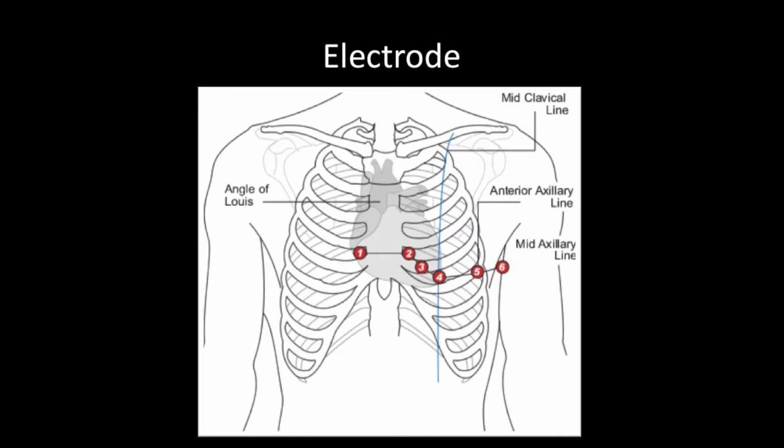If you're standing in front of the patient, the patient's standing up. You don't have him stand up, but we're just pretending. Patient stands up, and you turn the patient sideways. I want to see that. I don't want you following rib curvature. That is not correct. Okay?